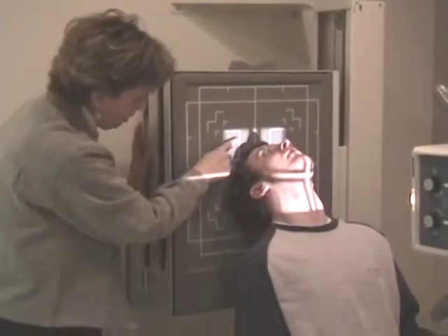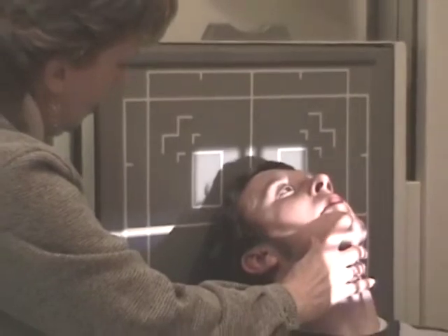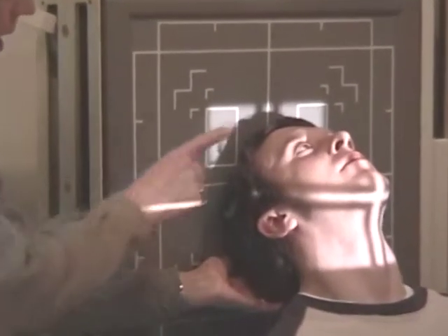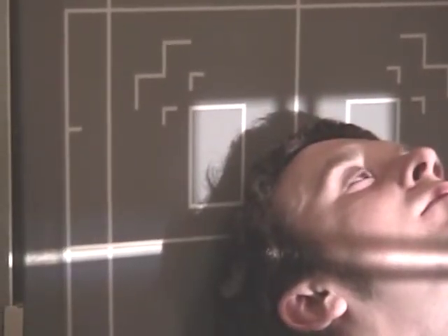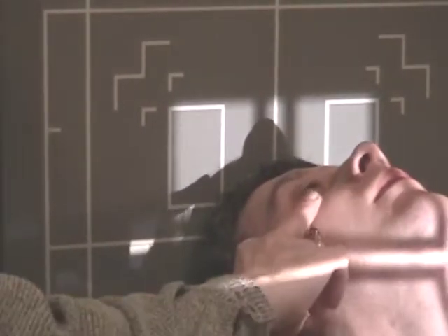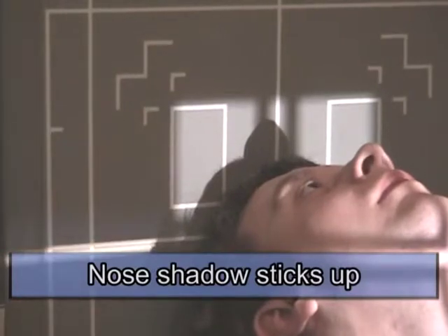Okay. I want you to take a look. Camera will focus in right here at the shadow here. That's our patient's nose. And it's a good indication that the infraorbital meatal line is parallel. Larry, we're just going to kind of tuck your chin for a minute, and then they can see that shadow. See what's happened to that shadow? The nose has disappeared, and you have frontal bone being demonstrated. If the infraorbital meatal line is parallel, the nose shadow sticks out there.